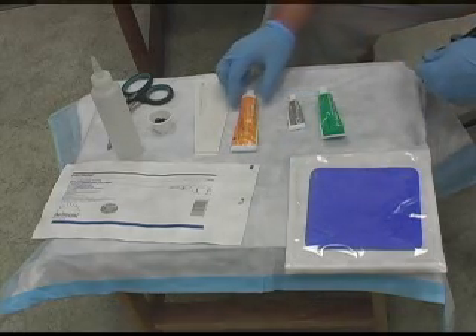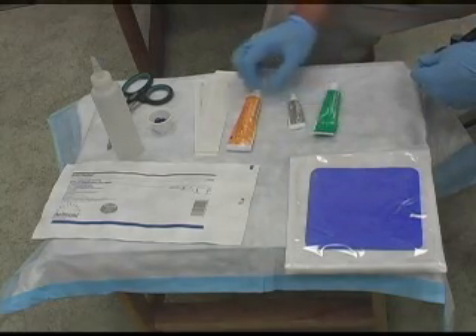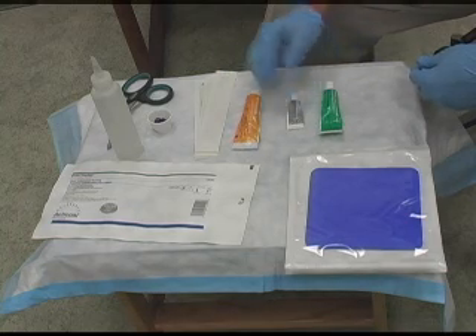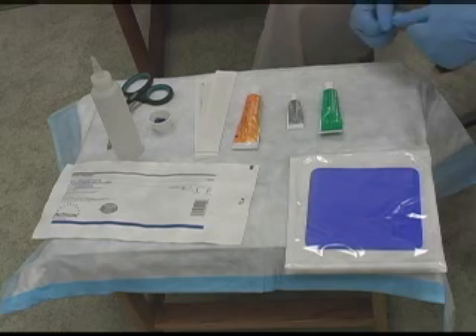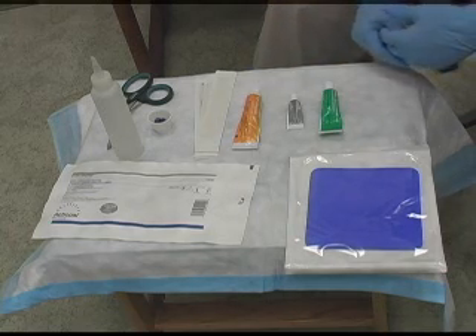These are some of the materials that we use here at the Wound Care Center for wound care. You still want to clean the wounds with normal saline and pat them dry with 4x4s before you use any of the materials that we have here.